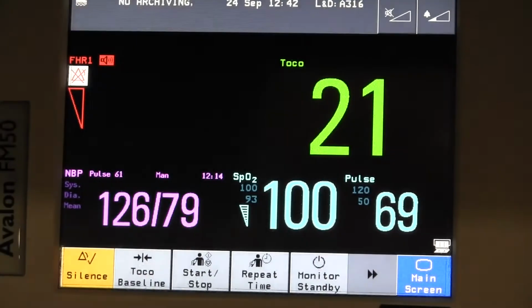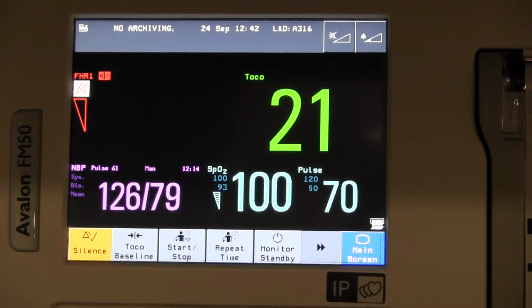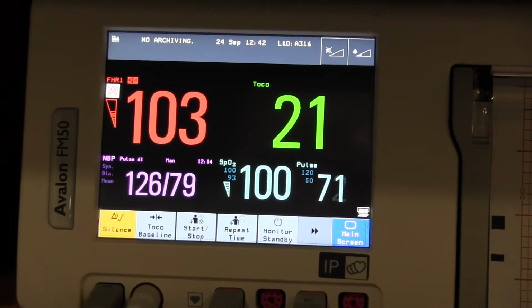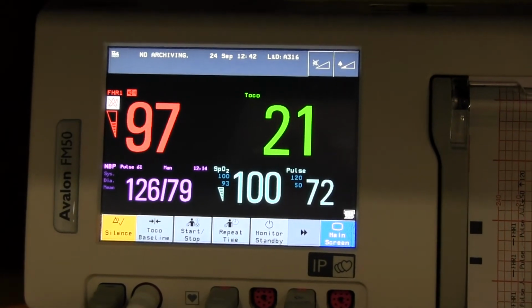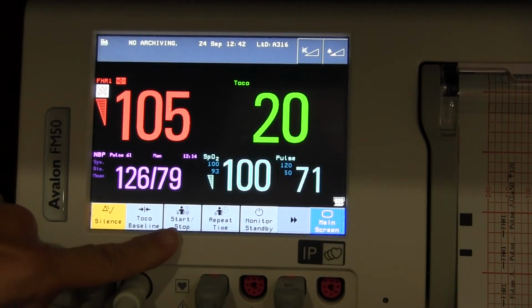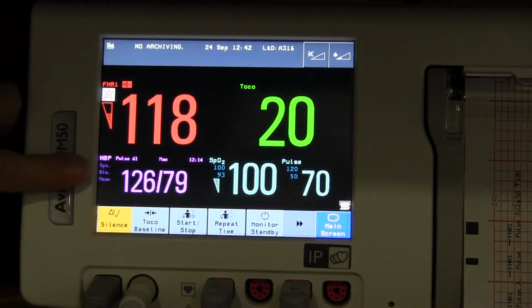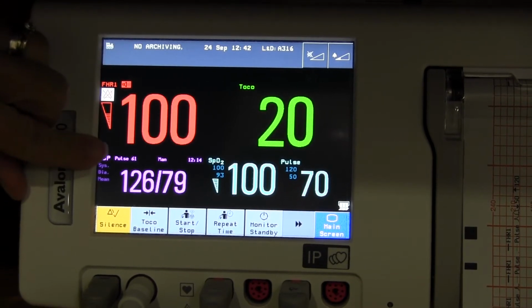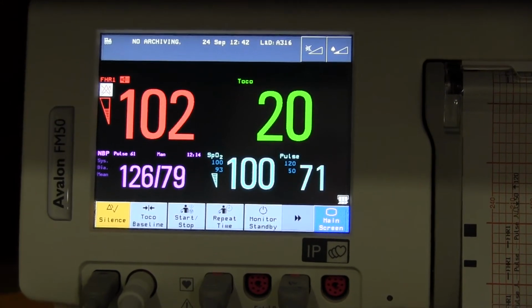And close your screen. To monitor blood pressure, attach a correctly sized cuff to the patient's arm. With the arrow scroll button, scroll until you find the blood pressure start-stop smart key. As soon as the measurement is finished, the blood pressure values with the pulse and the timestamp are displayed. The color of the maternal pulse will match the color of the device used to obtain the pulse.